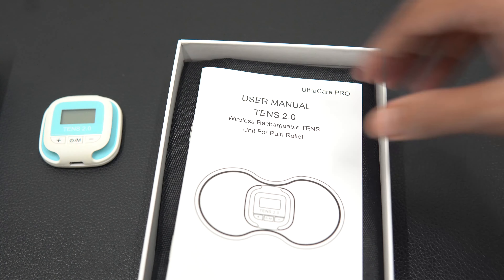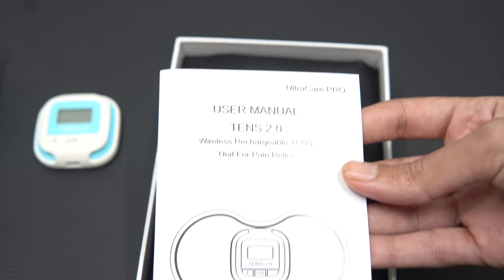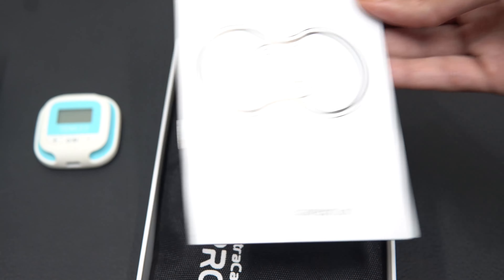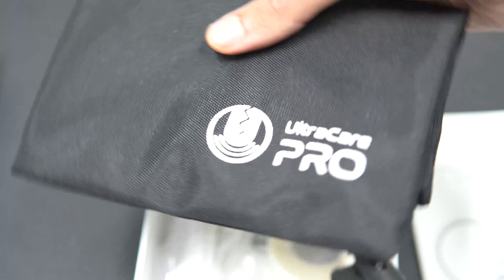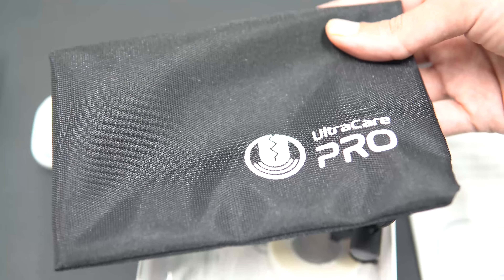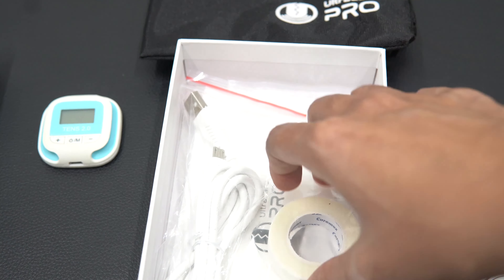The next thing you can see is the user manual, which will help you to use this product easily. You also get a cute little branded pouch by Ultra Care Pro. Next, you get some accessories like adhesive tape and a USB charger.